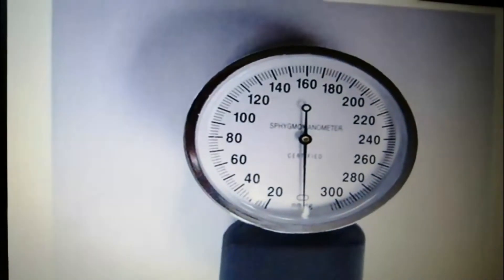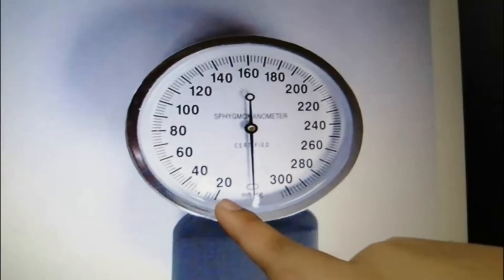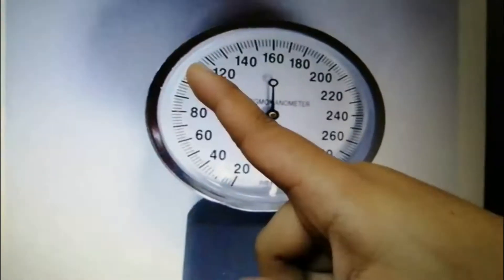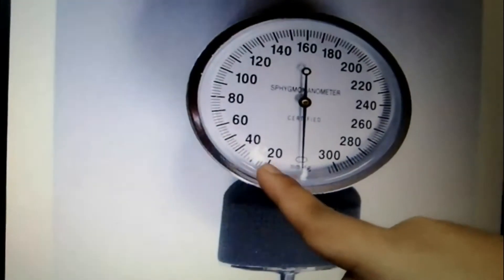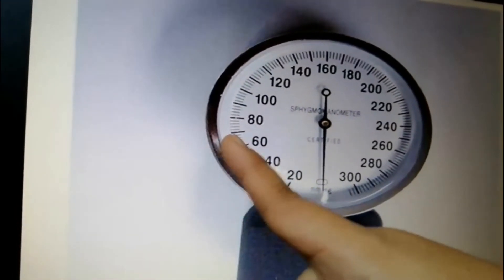Now, how will you read using the aneroid gauge? As you can see: 20, 40, 60, 80, 100, 120. At each part, the middle line represents increments by tens — so 20, 30, 40, 50, 60, 70.